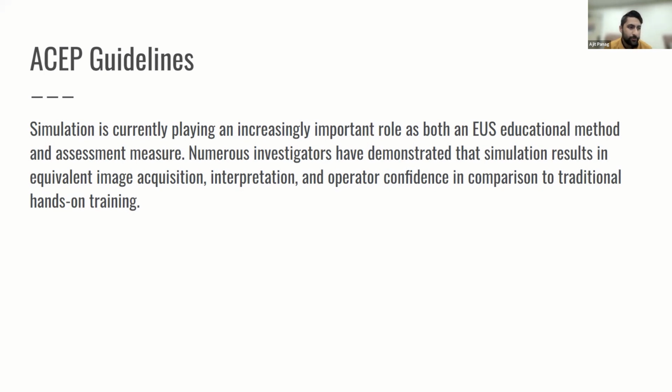So the use of this deliberate practice, as we'll go through some literature, actually improves the success rate of invasive procedures, where it really has the most data supporting its use in procedural ultrasound. And it's actually been shown to reduce patient complications, especially in the realm of something like central venous access.